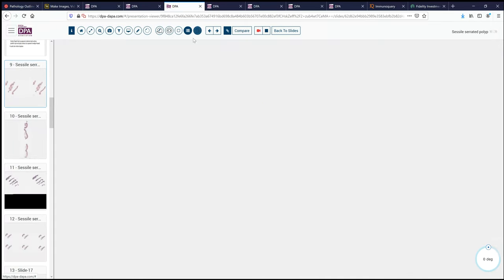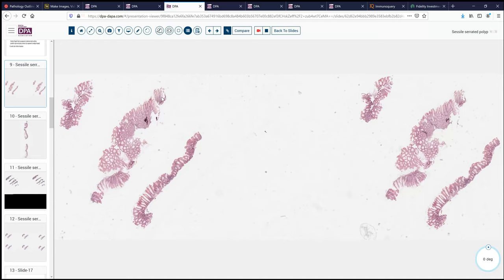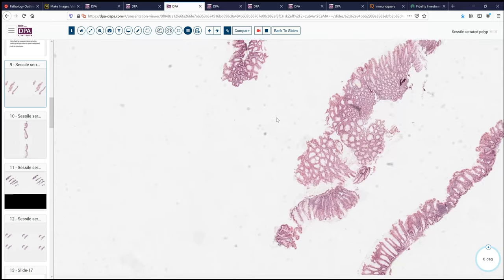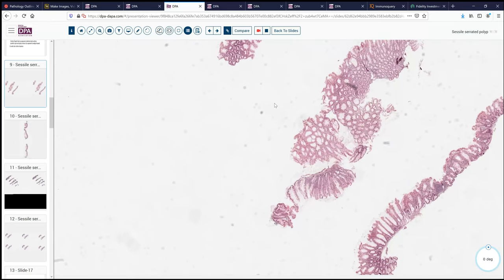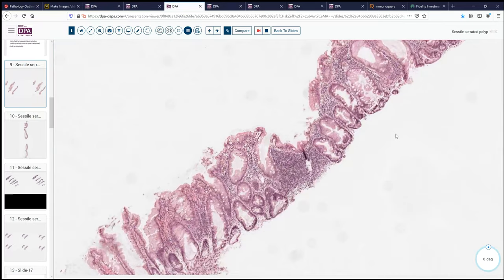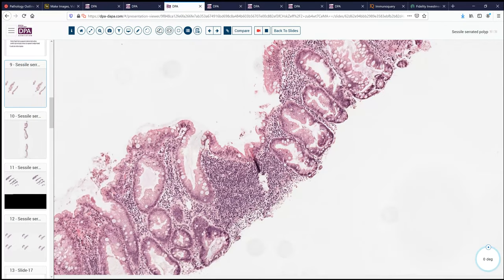I have several slide examples to allow you to get familiar with these features. These slides are all annotated in the presentation, so I'd encourage you to come back and review them. Here we see variable size — several millimeters in length across these polyps. It's not wedge-shaped; these are fairly uniform. The serrated architecture shows this undulating surface, in and out, up and down, with indentations. You can get all sorts of interesting shapes if you focus on the clear space in these glands — everything from stars to running men to a snowman. We then see that the deeper portions of the gland start to dilate and spread out.